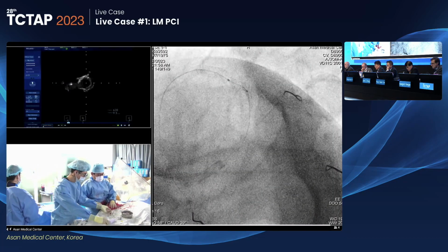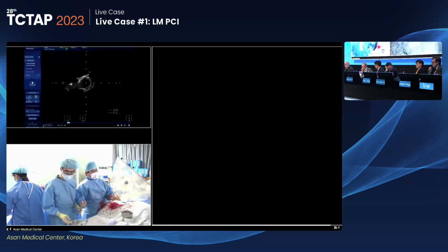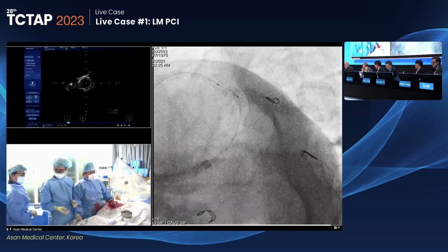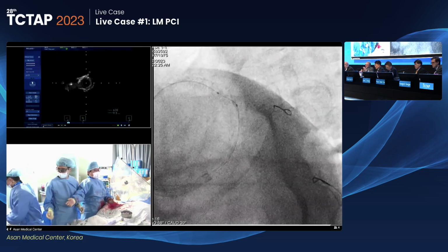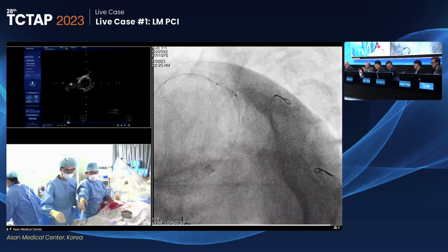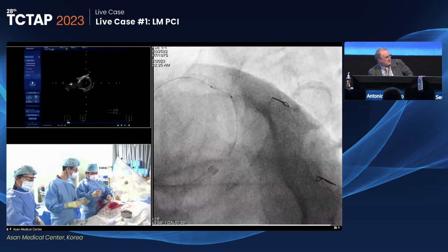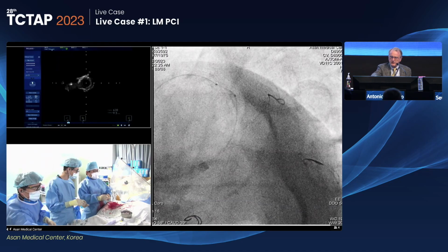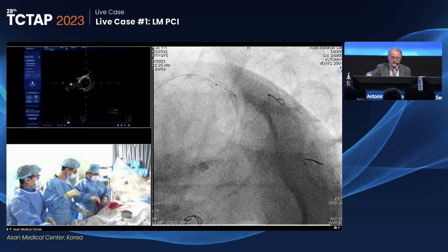Anyway, one other comment, Antonio. I know your preference is to do single stent crossover, but this lumen area and plaque burden is going to make that tough. But you can make the decision after pre-dilatation. The problem of the circumflex is that there's so much diffuse disease downstream.